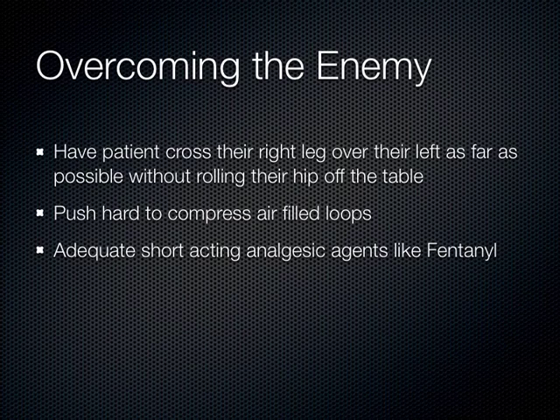It doesn't hang around for a few hours. It's completely gone in 20 minutes. And so we use that a lot, actually. So I go in the room with the nurse and say, okay, you push the fentanyl, I'll start the ultrasound, because it starts working almost immediately when you push it.